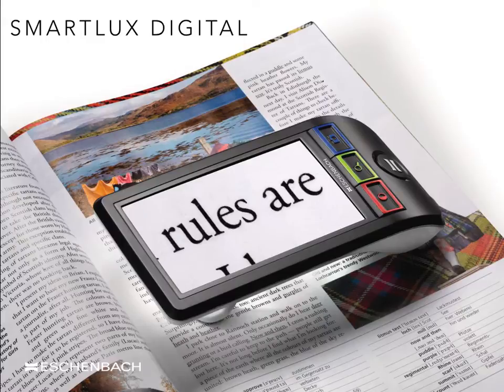With digital displays, the larger the size of the screen, the more words will be in view at any one time. This is termed the field of view. With a larger than average screen size, the SmartLux offers a good field of view for a portable device, even at the higher levels of magnification. The screen is now displaying 12 times magnification of standard sized print.